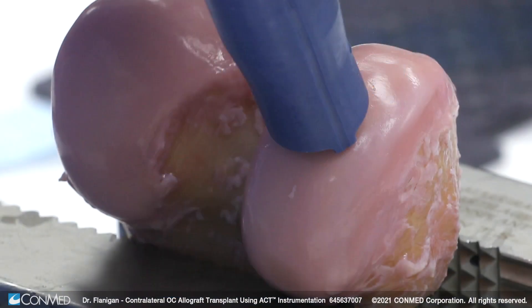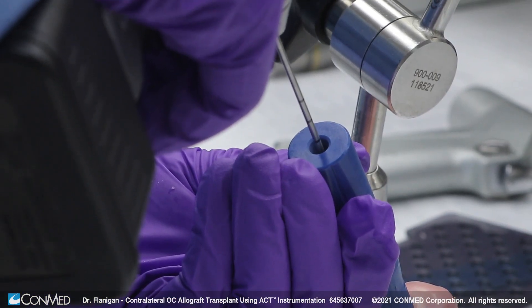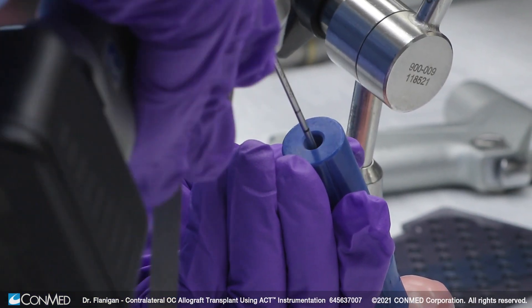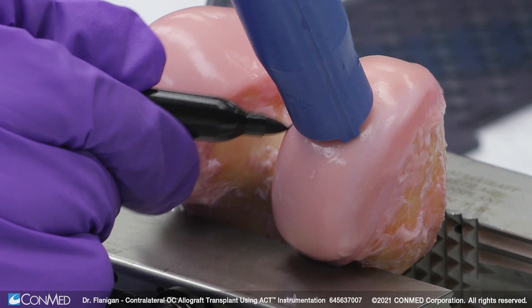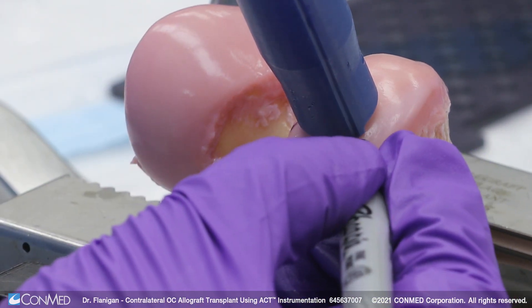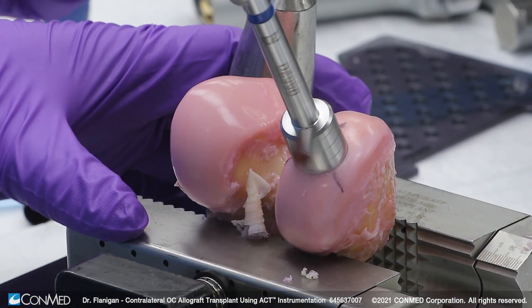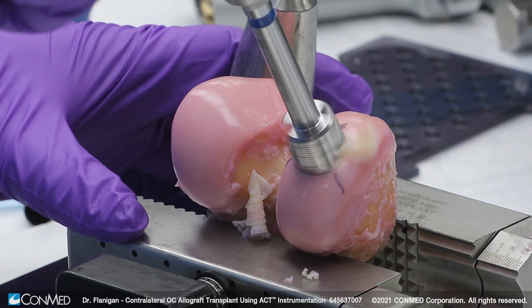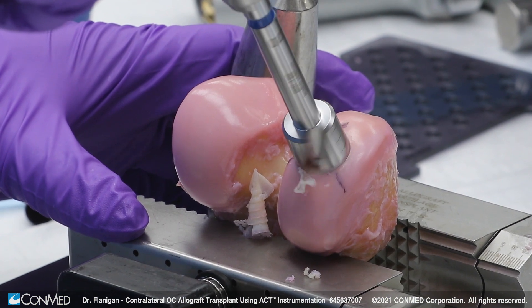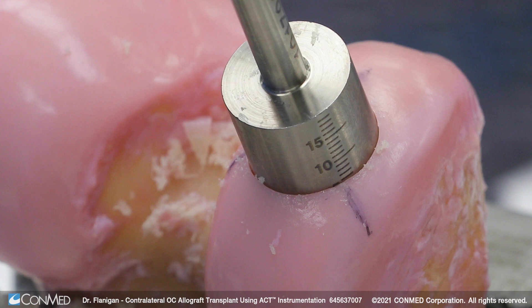Here we have prepared the recipient site on the medial femoral condyle. We want to capture the depth of the lesion at the 12, 4, and 8 o'clock position of the recipient condyle. These measurements will be used to fashion the implant to the correct size after we create our donor implant.